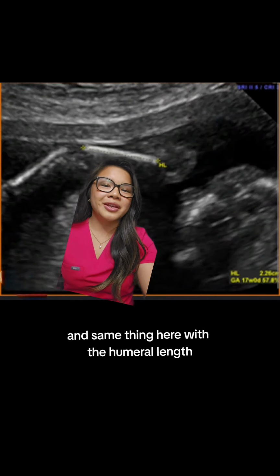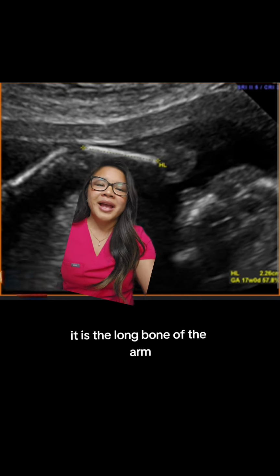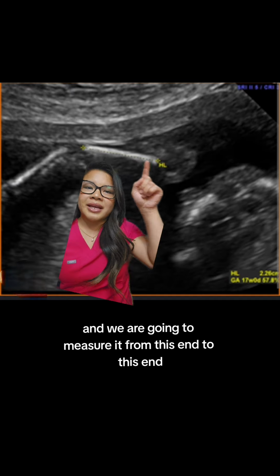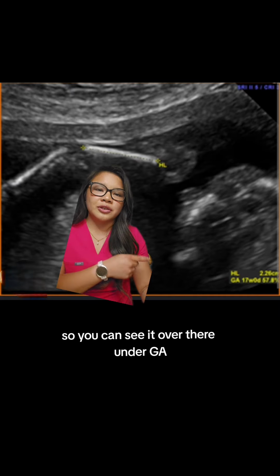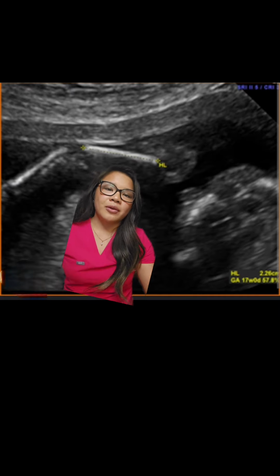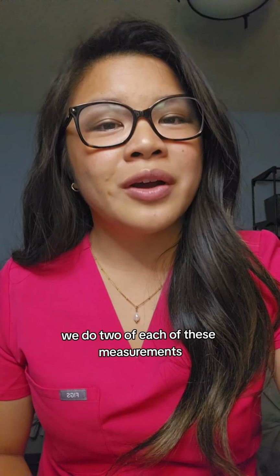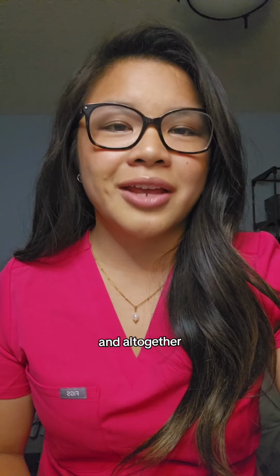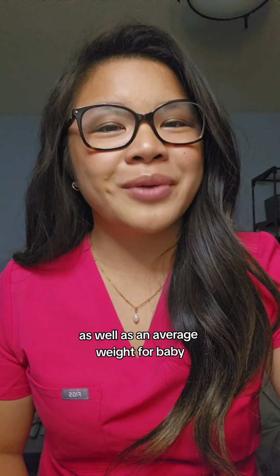Same thing here with the humeral length. This is the humerus, the long bone of the arm, and we are going to measure it from this end to this end. And again, it's going to come up with a gestational age, so you can see it over there under GA from our measurement, and the ultrasound machine is going to come up with that. We do 2 of each of these measurements, and altogether they are going to generate an average gestational age for baby as well as an average weight for baby.